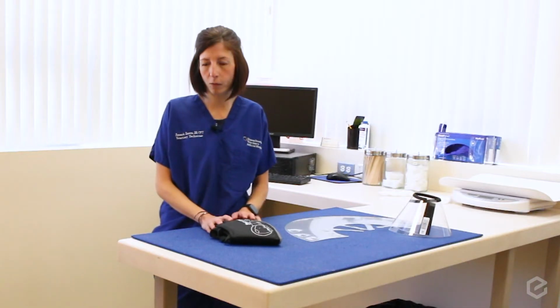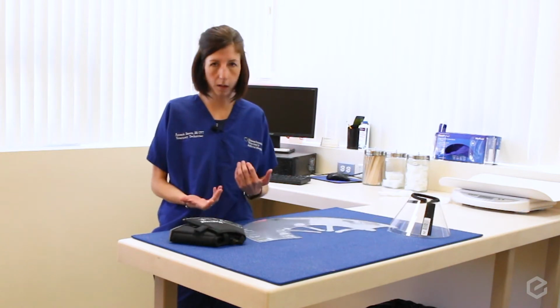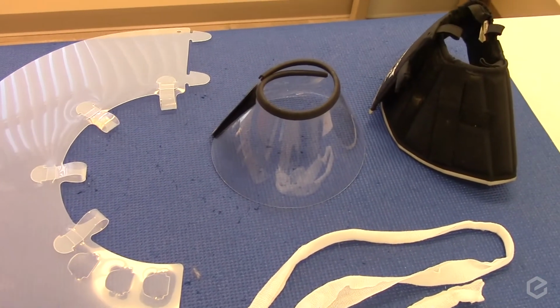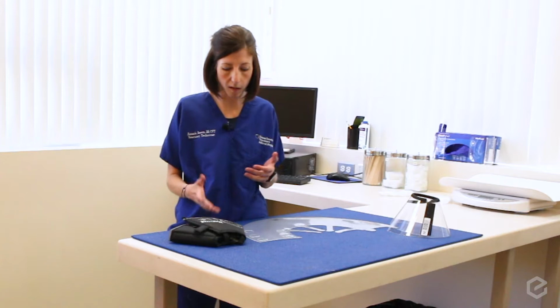Going to show you how to put together and put on an e-collar on your pet. First, just to kind of go over a couple different versions. We have a few different versions that you can purchase at your hospital or over the counter in any pet store. There are more versions than what we have here, but these are just a couple.